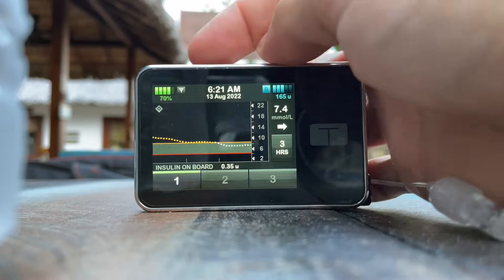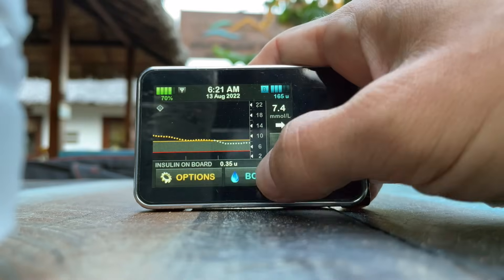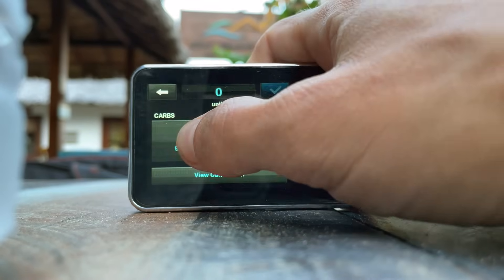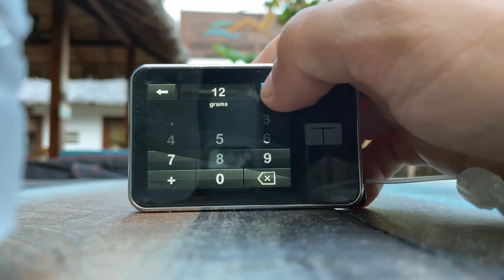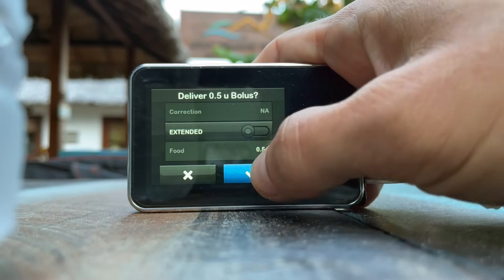Now here's what bothers me a little about this pump. Tandem placed a lot of focus on safety features, which some might find positive, but I personally feel it's a little overkill at the expense of user experience. For example, when you want to initiate a bolus you go through quite a long series of steps — from waking up the pump and unlocking the screen to clicking through confirmation screens where you just OK information you previously entered. There are a few too many screens.